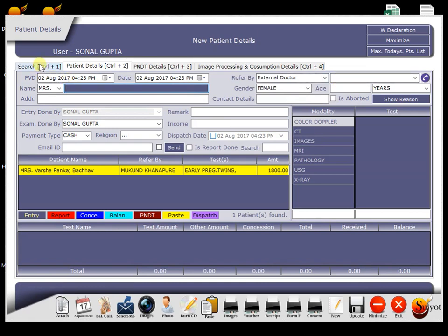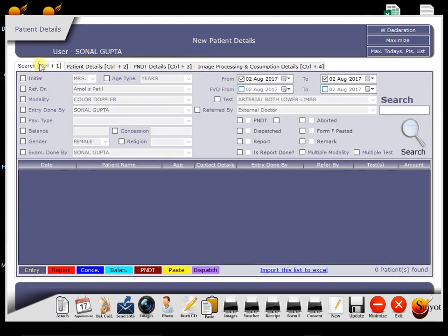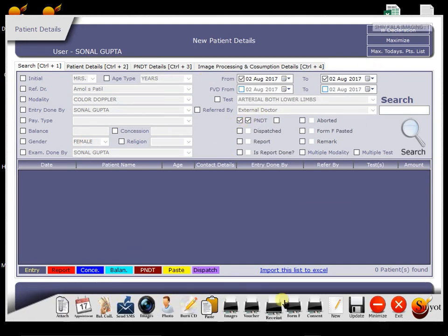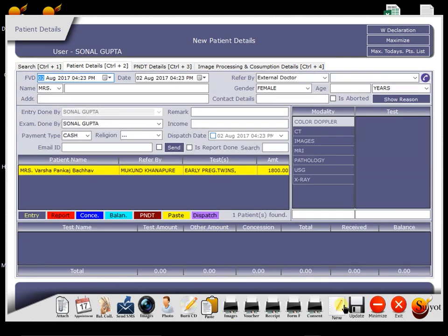The first is Search. In this tab, we can search old patients. There is vast criteria given for searching. At the bottom of the screen, all buttons are provided to operate software. Like now, consider we want to do new patient entry. Then I press new button. So this screen appears before us.